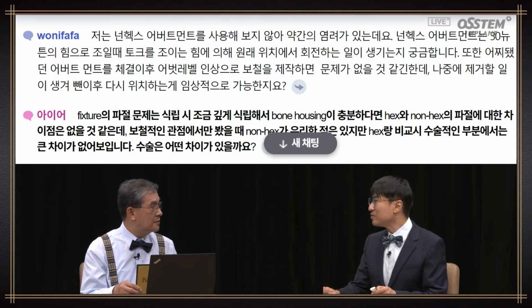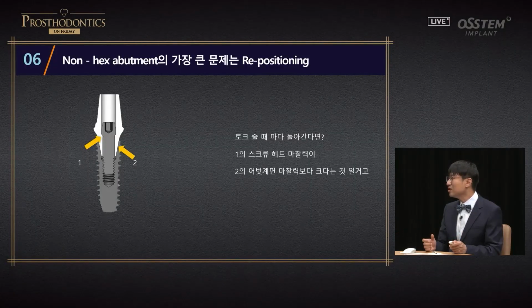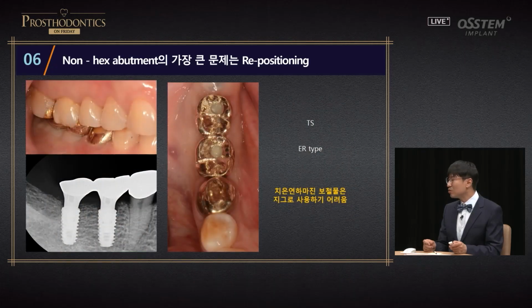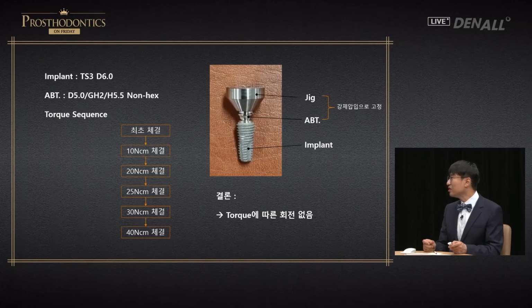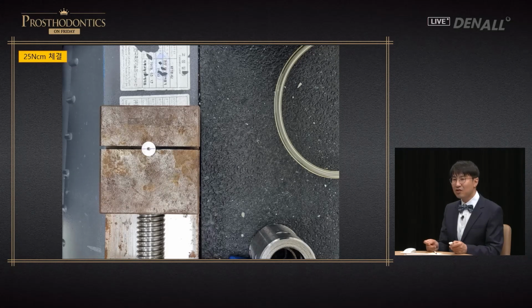To give you a conclusion, there's no straight answer because whether the abutment is original product or generic product can come into play. And even if it is original product, this problem can occur. In the case of original abutment, if you tighten with your hands and gradually increase the torque, as shown in the research that I've shown you earlier, if you connect the abutment and rotate it slowly, 10 Newton, 20 Newton, and 30 Newtons, then the change that is detectable to the human eye is bare minimum. If you do it rapidly, there can be an issue.